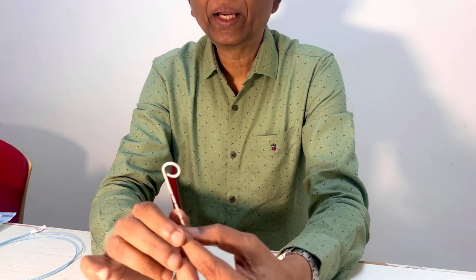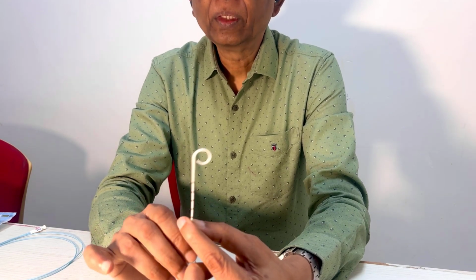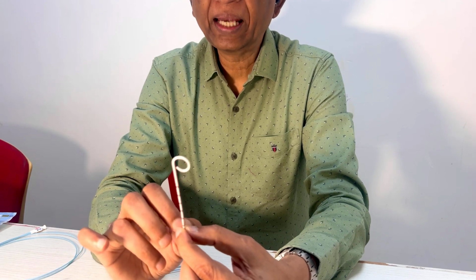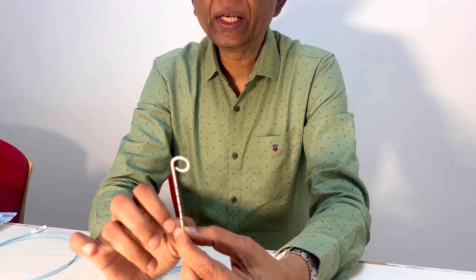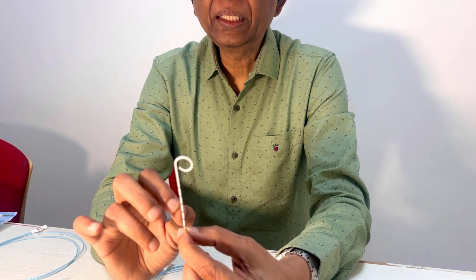Now, you may ask, why do you need a small pigtail? It's very useful in just one procedure. If you want to puncture the femoral artery absolutely in the center, then you'll ask, why should I puncture exactly in the center? Typically, this puncturing in the center is used when you want to do a total percutaneous procedure where a large sheath is used. So where do you use a large sheath? Not in neurointervention, but for aortic stent grafts.